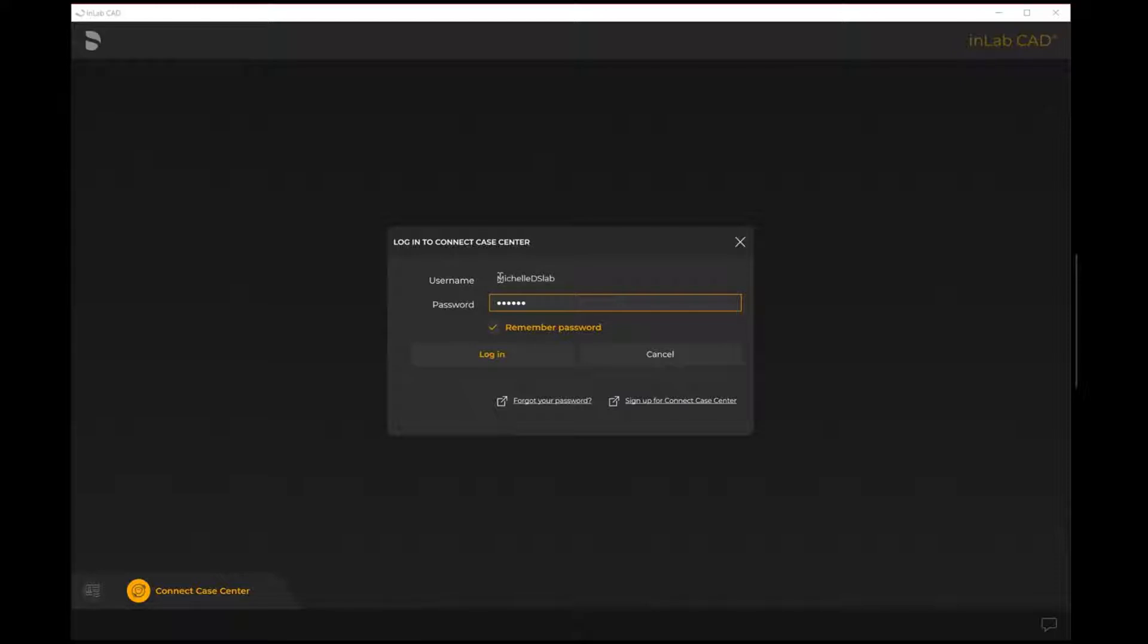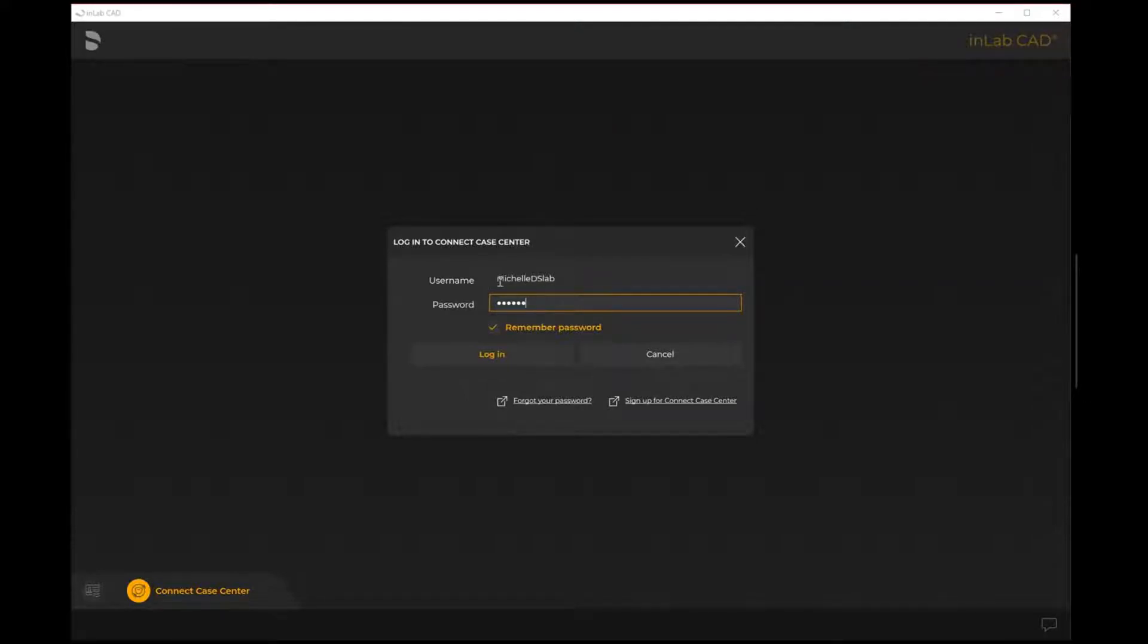Your username is usually like that of a social media handle, similar to Instagram. It's not based on your email, it is based on a username. You can see here mine says Michelle DS lab and then my password is input here.